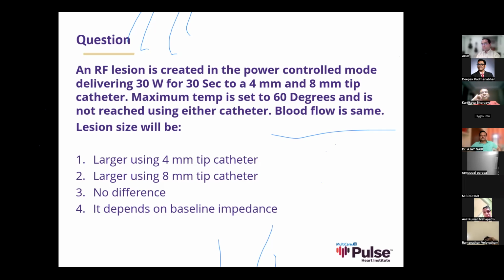We have some ways to decrease impedance. In the coronary sinus, the reason you have higher impedance is that the tissue is all around the catheter tip, surrounding it and touching too much. So we do something called pre-irrigation. We irrigate for 5 seconds before we even start the ablation, and that reduces the impedance, because then you have a little more space for the catheter, and then you can ablate. Even then, you have to use lower wattage, because sometimes if you ablate with a higher wattage, the impedance goes up very quickly.